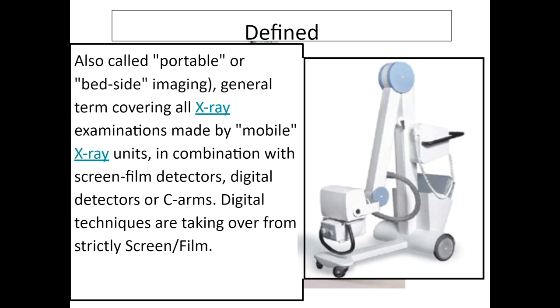These, though, even smaller ones, will fit in the back of a car, in the back of a trunk. So for real mobile radiography, there are companies. I worked for one once, and it was the worst job I ever had.